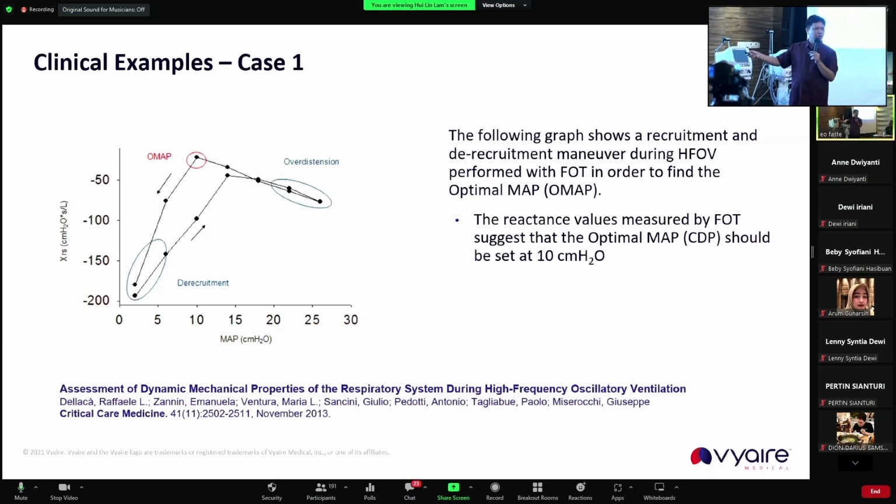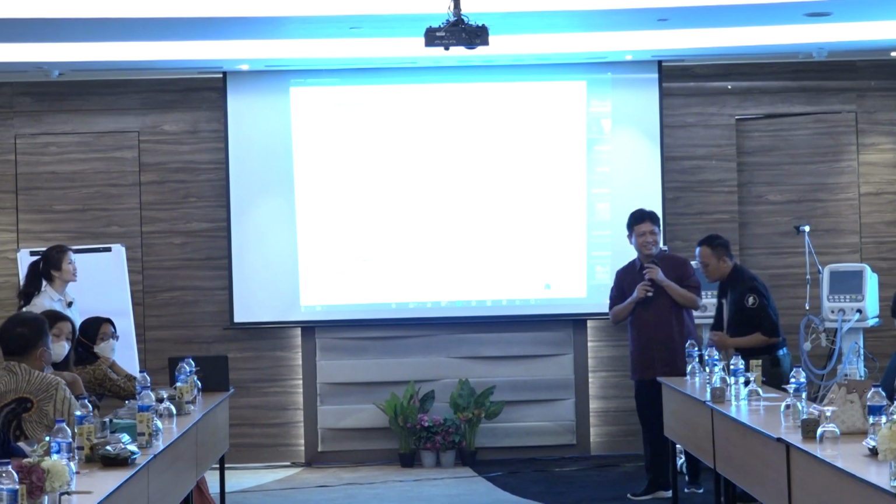Nanti kalau rekan-rekan mulai gambarnya langsung turun ke bawah, itu artinya udah ngembang ya, nggak usah ambilnya yang paling pojok, yang paling tinggi. Beda sama kurva PV loop ya. I think it's all. Okay.